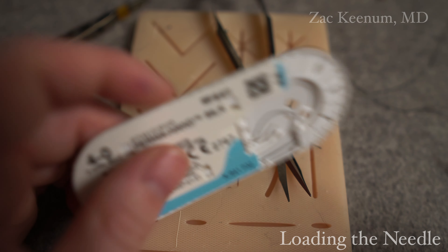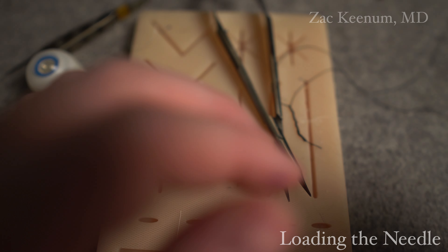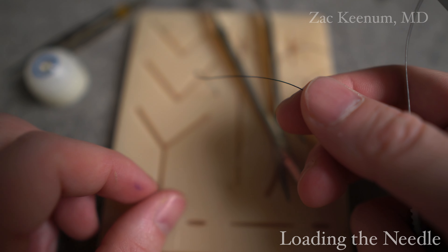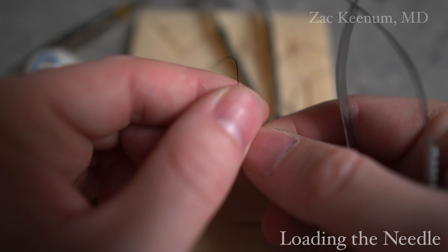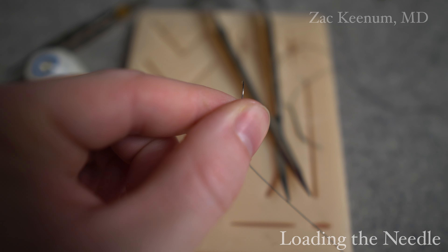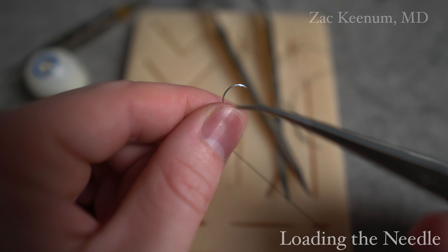First, let's talk about how to load the needle. So I'll take it out of the package here. This is something that gives residents trouble in the beginning. First thing I'll normally do - I grab it in my dominant hand, grab my non-dominant hand, slide it through my fingers. I now have control of the needle. I can spin the needle. Remember our mnemonic: funny ducks by underwear, FDBU.